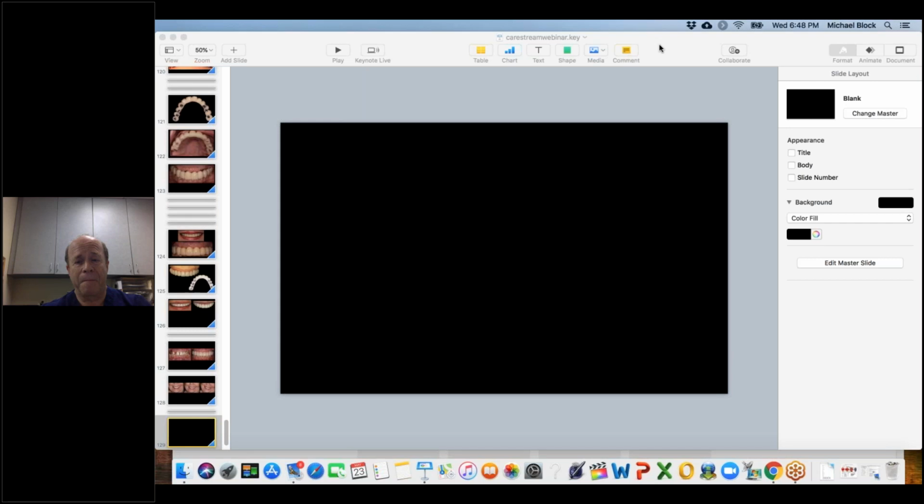And how does the digital workflow make implant planning easier? Well, the digital workflow makes it easier for me to know where to put the implants, because I get the STL image and I superimpose that onto the CT scan. And then when I do that, I can very easily put the virtual teeth and I'm ready to go. So it makes it very fluid. There's no missing steps. I don't have to rely on a lab doing something. I don't have to rely on my referrals seeing the patient. The patient does not have to go to 3 different offices to get something done. We can do everything right there, which is really good for the patient.